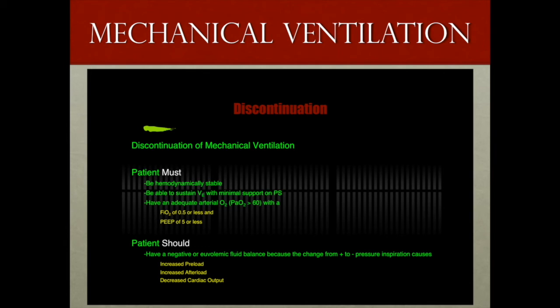So a lot of times patients will be ready for extubation, and it may be held off to allow for several hours of diuresis, with the understanding that when the patient transitions from positive to negative pressure ventilation, their pulmonary edema would increase without that diuresis.